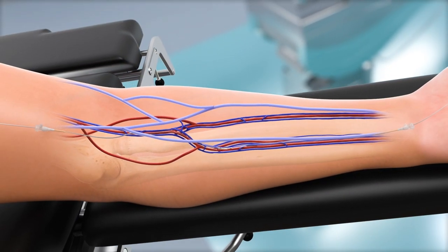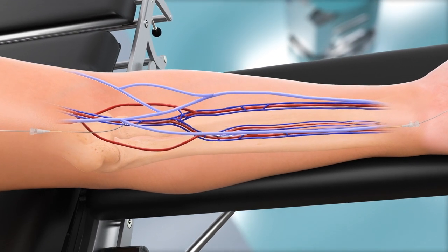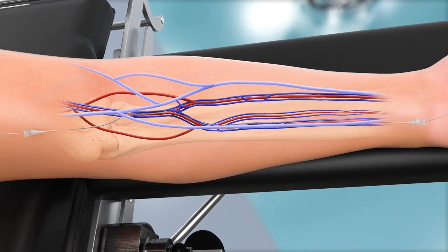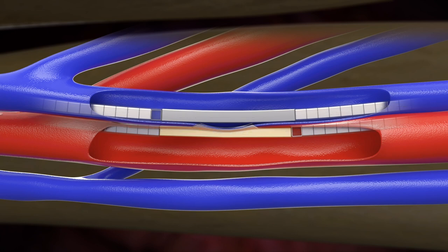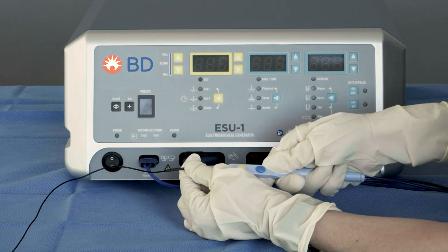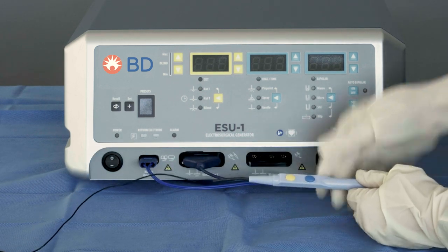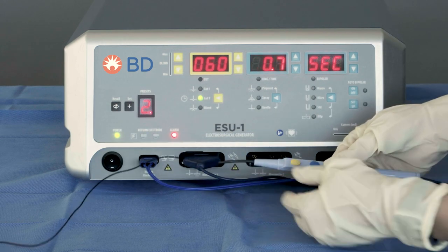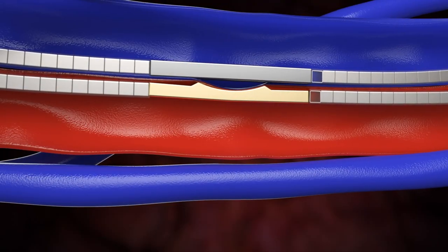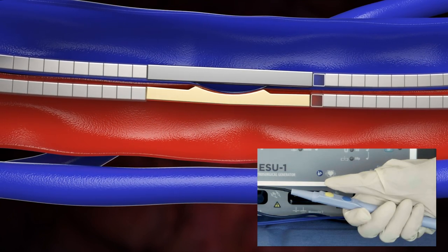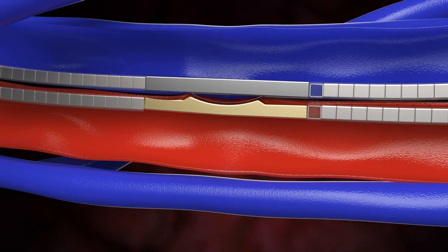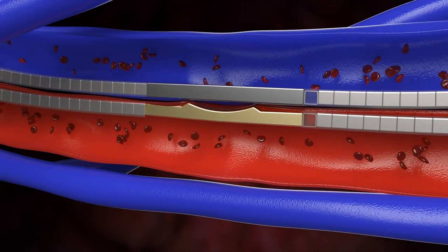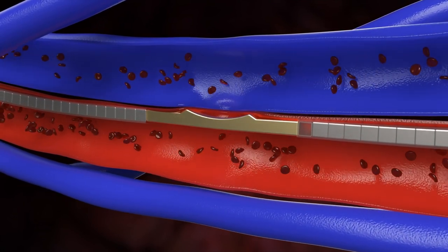These steps remain the same for the anti-parallel approach; the catheters will just advance from opposite directions and the rotational indicators will be in different locations. Regardless of the approach, confirm that the catheters are properly aligned. Under fluoroscopic guidance, remove both guide wires. Connect the venous catheter to the electrosurgical generator via an electrosurgical pencil. Turn the generator on and ensure settings are programmed accordingly. Under fluoroscopic visualization, press and hold the yellow cut button on the electrosurgical pencil to create the channel between the artery and vein. After activation, remove the venous catheter followed by the arterial catheter.